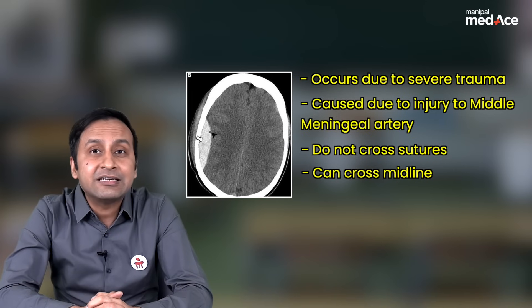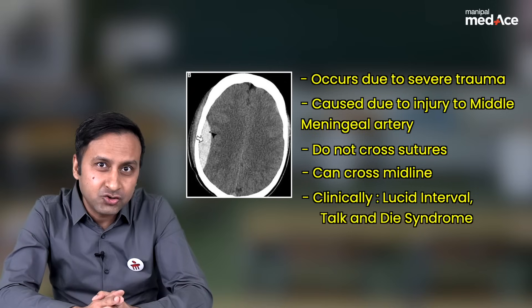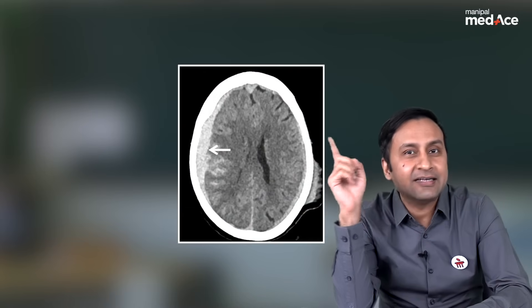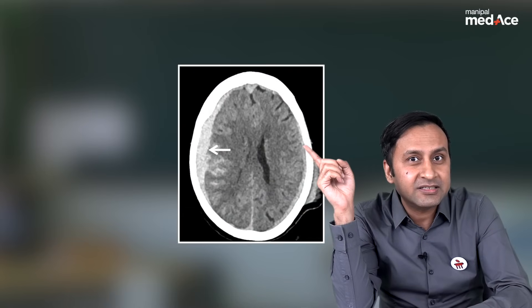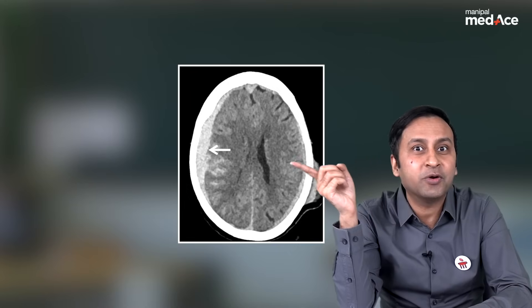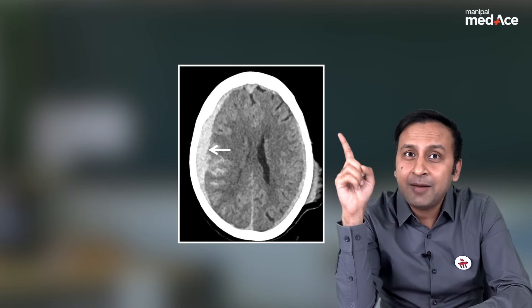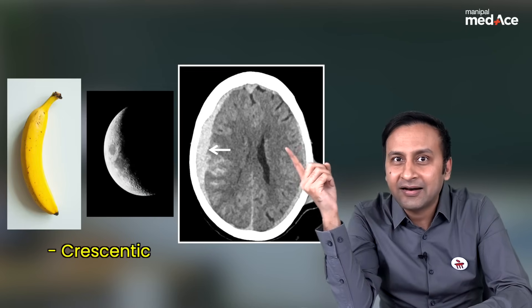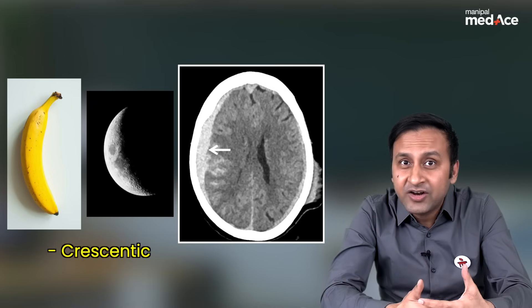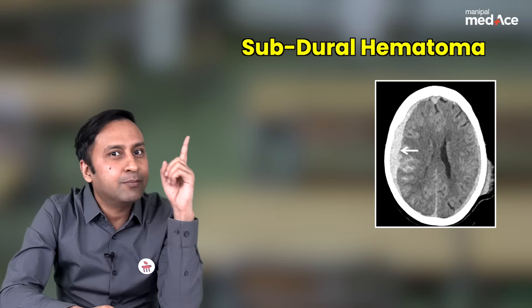Some of the important classical clinical features associated with EDH are the talk and die syndrome and the lucid interval. Now, let's have a look at our second example. In this CT, you can see an extraaxial hyperdensity over the right parietal convexity, but there is a change in the shape — the shape is that of a crescent or a banana. If you find this crescentic or banana-shaped hyperdensity which is extraaxial in location over the cerebral convexity, this is an example of a subdural hemorrhage.